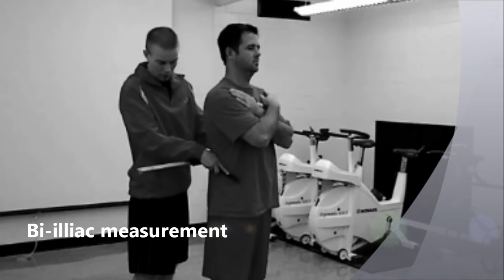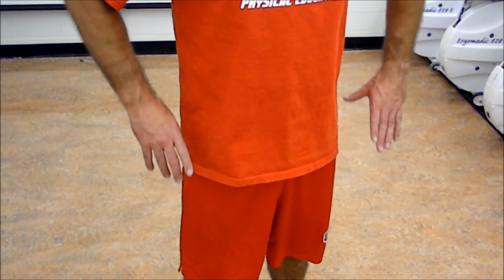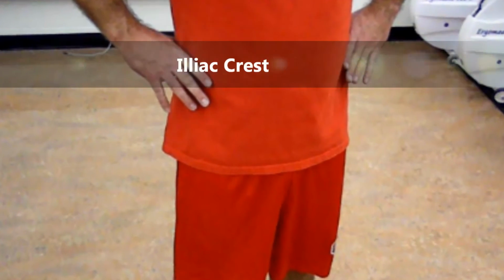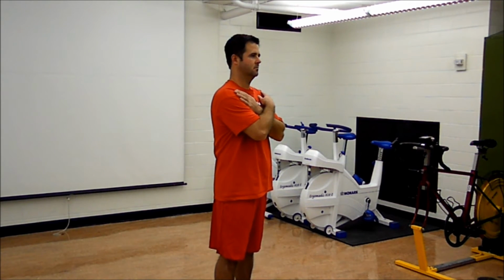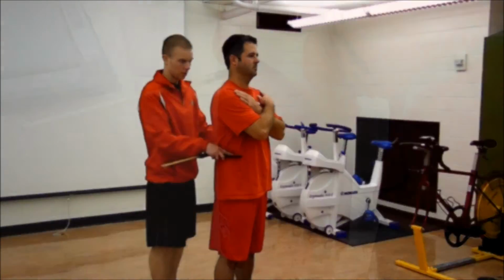The anatomical reference points for the bi-iliac skeletal diameter measurement are the iliac crests. The participant should be standing upright with the arms folded across the chest. This allows the technician to have an unobstructed view of the anthropometric caliper.